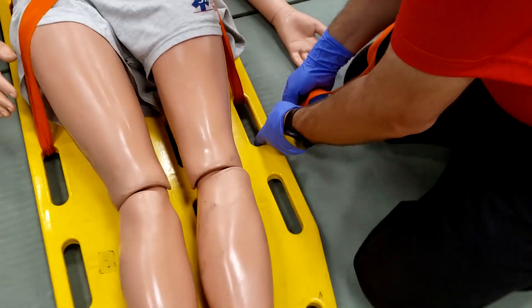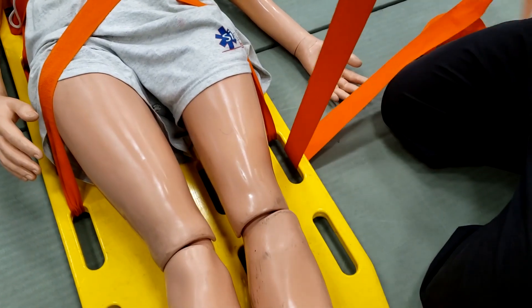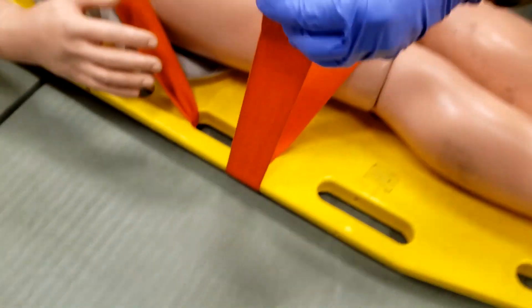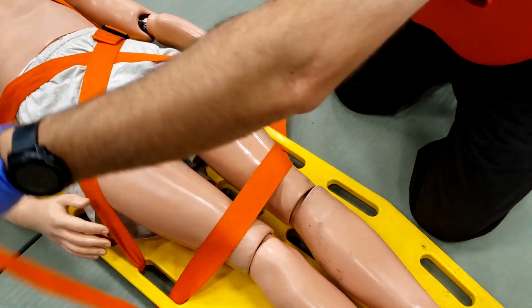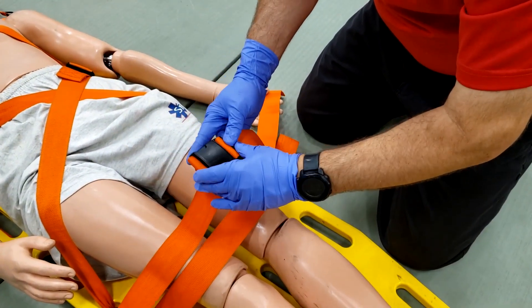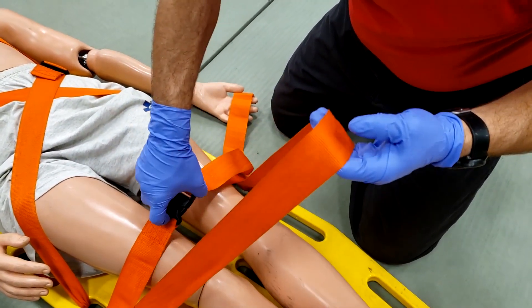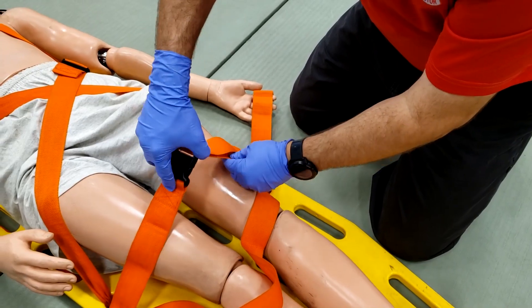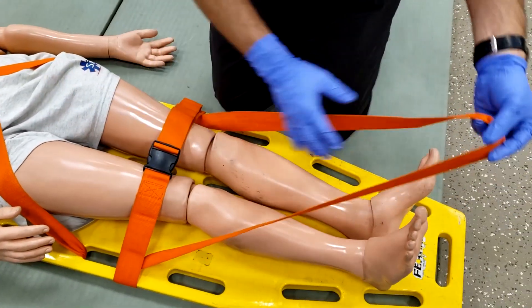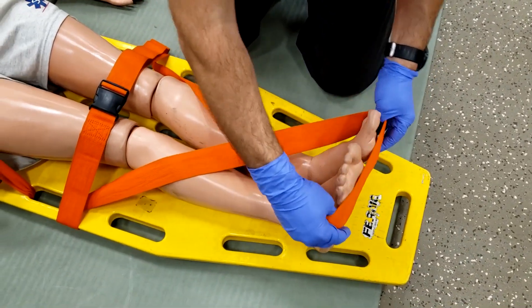To strap the patient's legs, begin with any buckle from under the board, feeding it and going across to the opposite side and then down through the board. Secure the buckles together. Place the buckle somewhere in between the legs and then bring the remaining strap down towards the patient's feet and create a criss-cross pattern by looping at once as you place it along the bottom of the patient's feet.